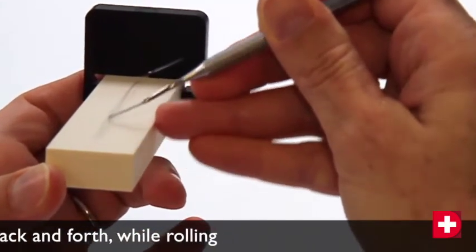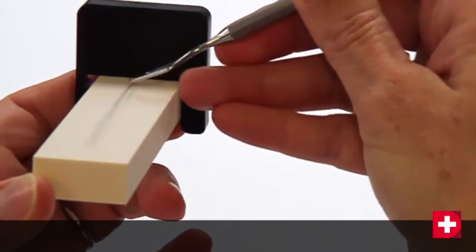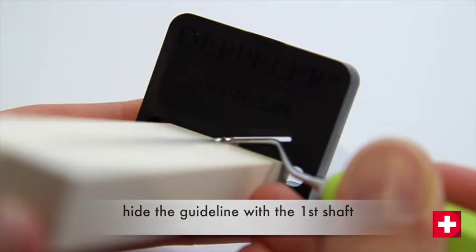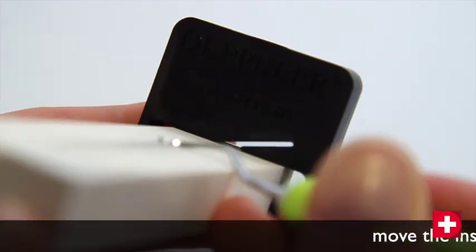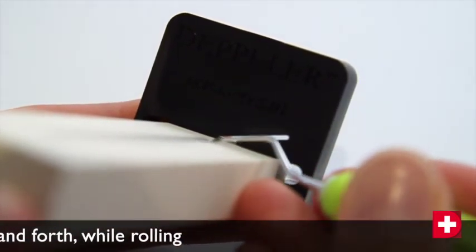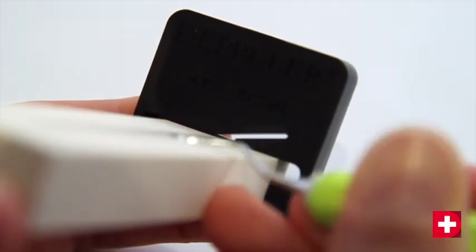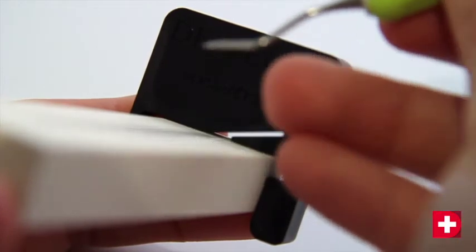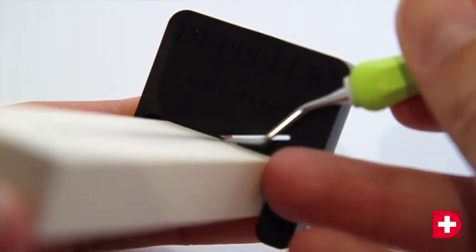For universal scalers and curettes, use the universal coach. The method is the same. Lay the lateral surface of the blade flat against the stone. Cover the guideline with the lower or terminal shank of the instrument. Move the instrument back and forth whilst rolling the handle between your fingers. Use a magnifying glass from time to time to check that the geometry of the blade has not been altered. Using a permanent marker, you may also paint the lateral surfaces of the blade to check the angle and the uniformity of your sharpening skills.